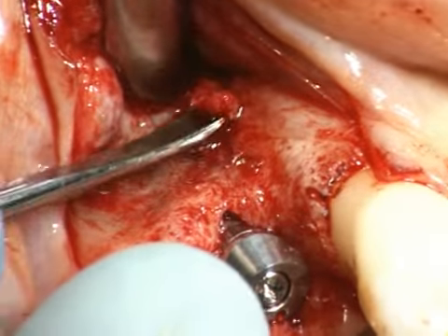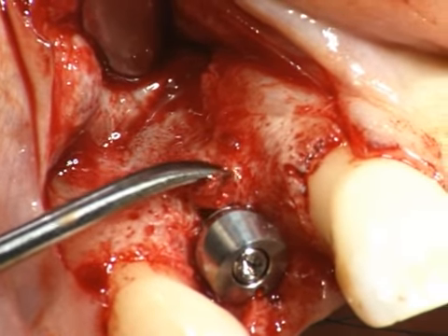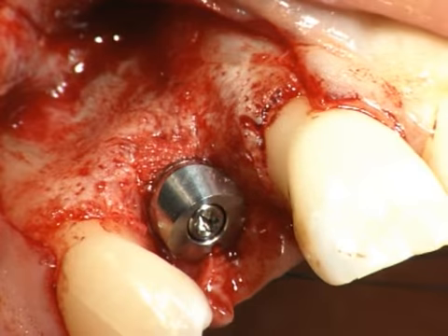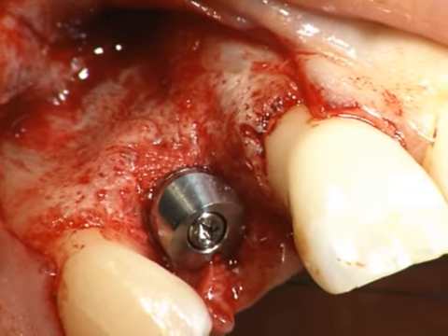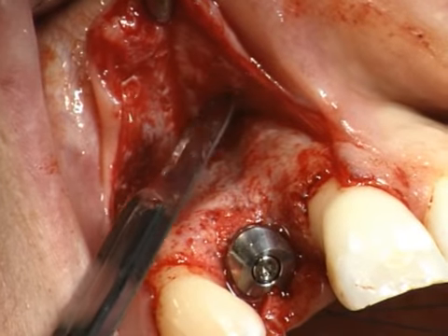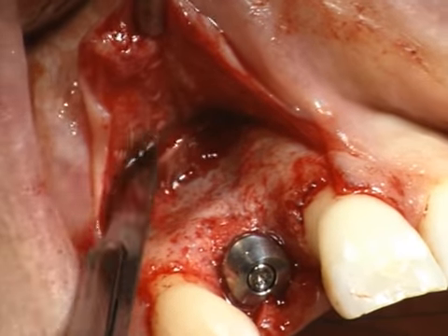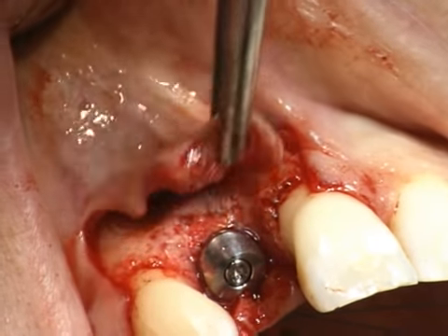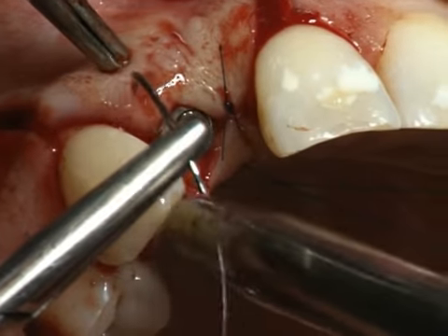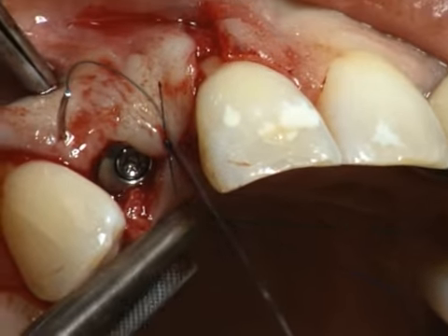Small chips can be taken directly from the immediate surroundings of the basal alveolar process with a sharp periosteal elevator. A membrane can be omitted, but the mucoperiosteal flap is relieved basally by a slit in the periosteum. This ensures tension-free wound approximation. The wound edges are approximated interdentally with atraumatic monofilament sutures.